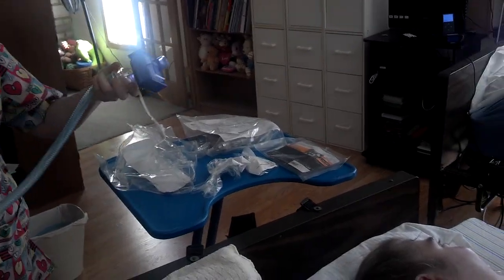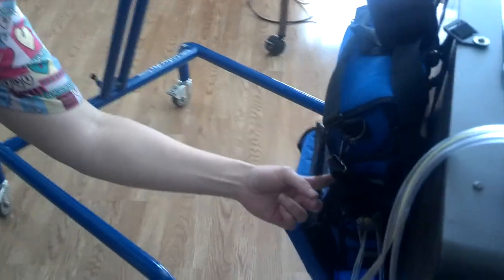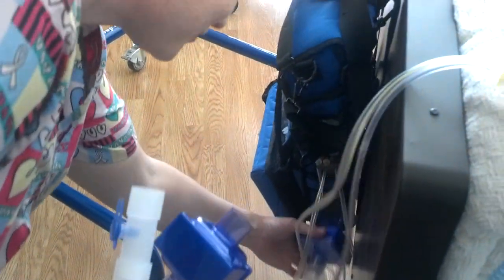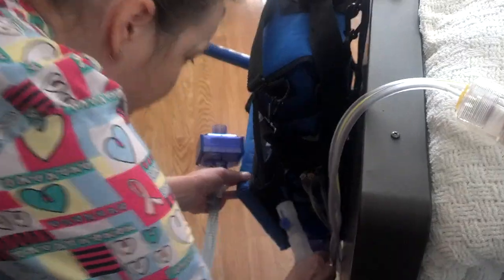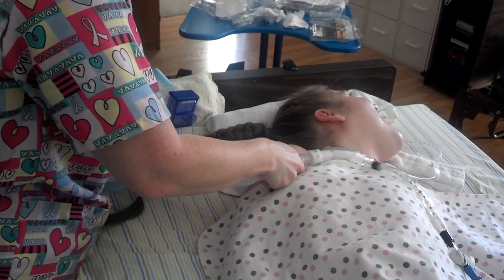In her left hand you have the ventilator end, in her right hand you have the patient end. Silence it first — don't scare her. So while she's doing this, Taylor's not getting as much pressure, but she's still getting pressure, which I believe is why Amy likes doing one side at a time.